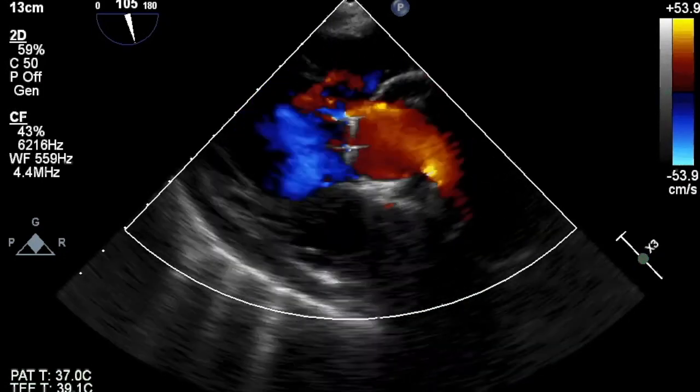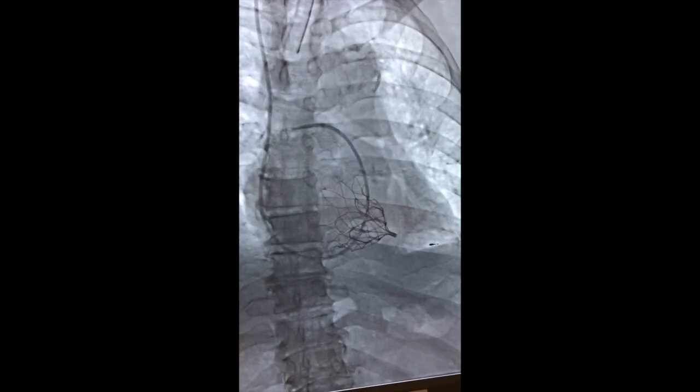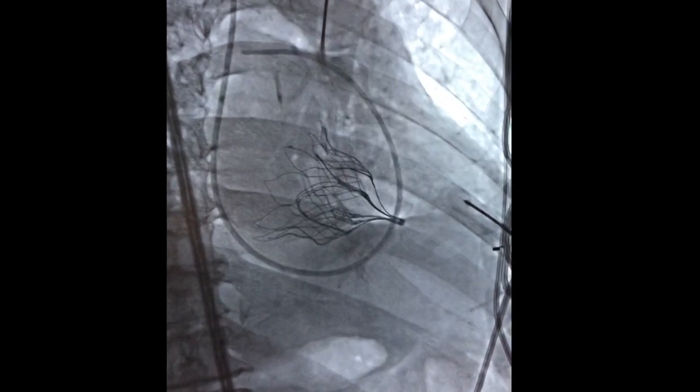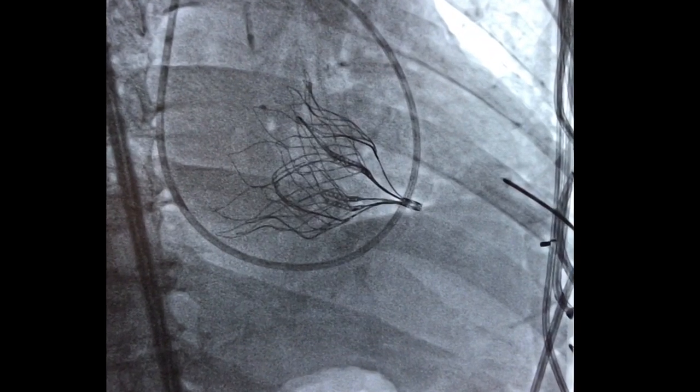You can see in transgastric views the valve is positioned appropriately, is stable, and no paravalvular leak is seen. After completion of the echo, fluoro is performed at the end of the exam to confirm the placement. You can see a marker on the anterior cuff that should be placed anteriorly, or on the right of the screen.